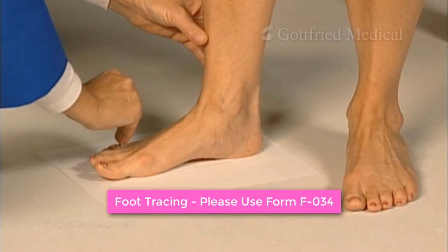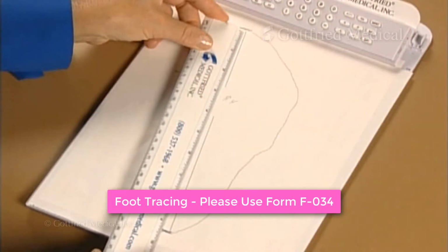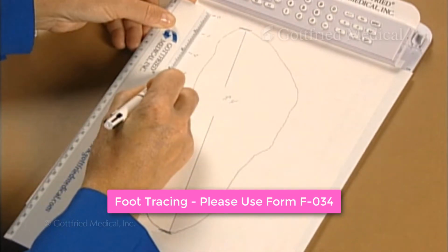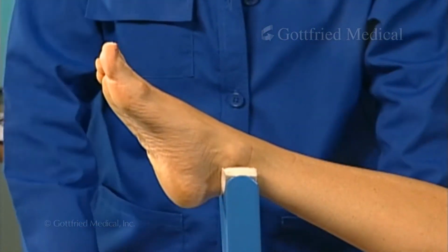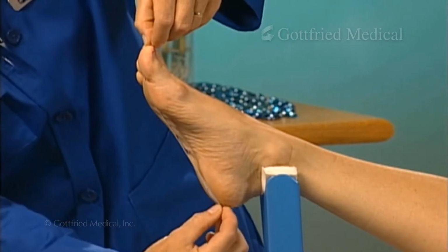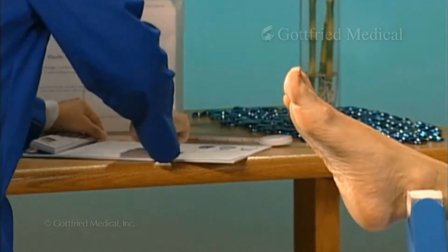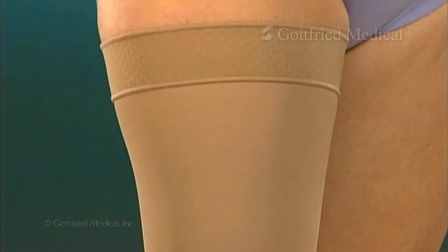Keep in mind that if you fax your order to us, the tracing may be distorted during transmission. To ensure accuracy, indicate the actual length of the tracing or provide 1-inch increments. As an alternative, have the patient or customer lie down and measure from the end of the heel to the tip of the longest toe. Then record the measurement on the order form. This completes the measuring procedure for knee length and thigh length supports.